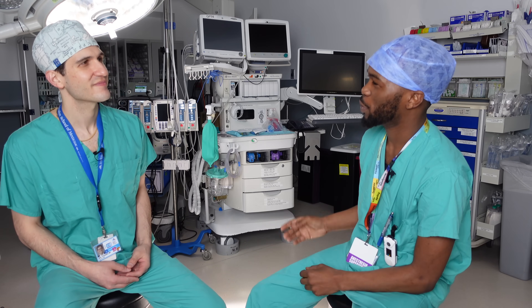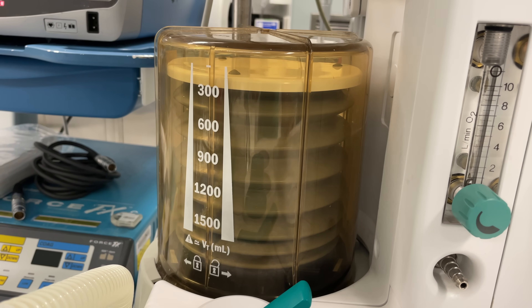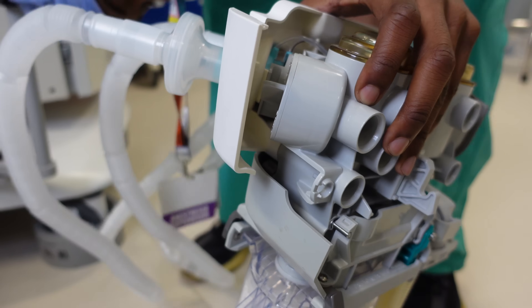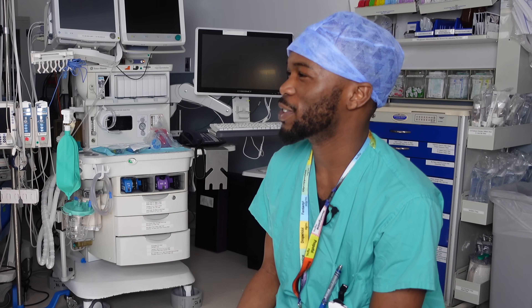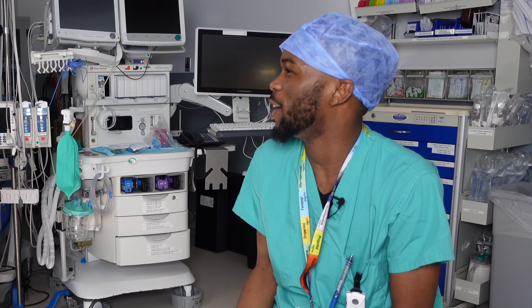The most stressful part of my job is when you can't figure out the problem with the machine, and you also have a patient that's undergoing surgery — it's very stressful. You want to know basically everything about the machine because when things like that happen, it becomes very stressful. What would you say is the most rewarding part of your job? Helping someone. When things are not working in the room, coming in, fixing it, and just seeing the joy on everybody's faces when I fix something.